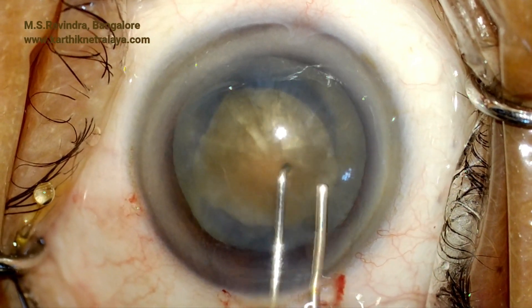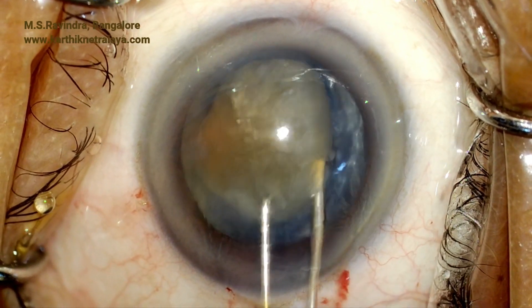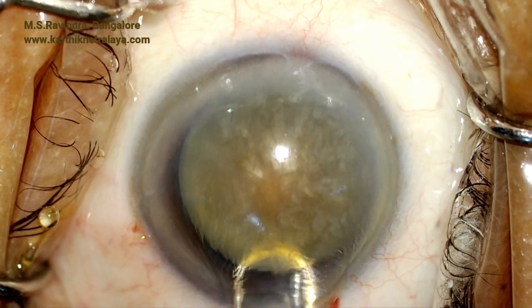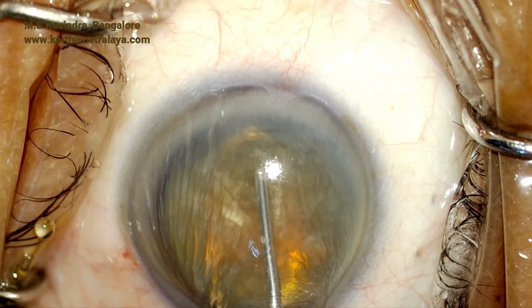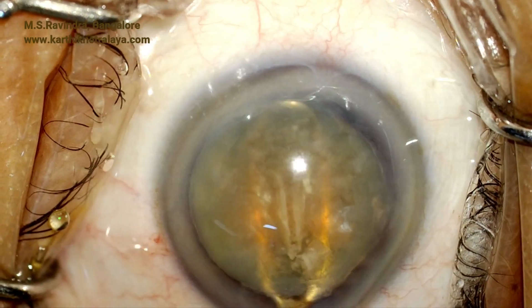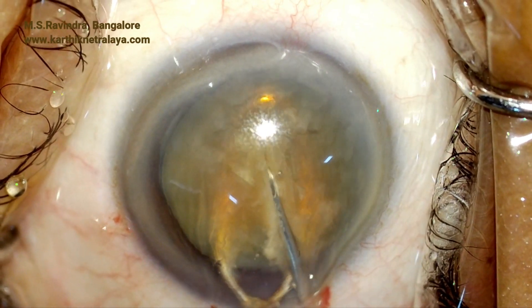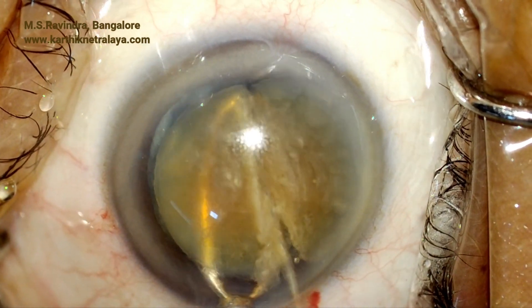The nucleus is now lifted out by manually pushing it to the left side with the hook and then rotating it into the anterior chamber, ensuring that zonules are not disturbed during this procedure. The nucleus is bisected in the anterior chamber. Usually a shaft of a 25 gauge cannula is used, but because of the hardness it is not slitting or bisecting effectively, so a Sinskey hook itself is used — bent at 45 degrees, not 90 degrees at the tip.